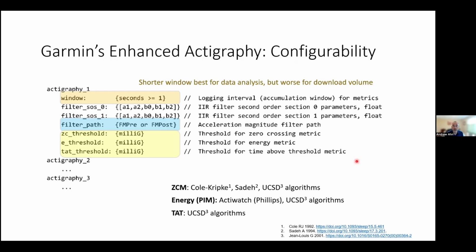However, if you initially record 60-second epochs, there's no way to back that down into more granular 5-second resolution later. So this flexibility in data analysis makes shorter epoch windows a more versatile choice for research, but it has the disadvantage of larger data volume and thus longer data transfer times for the participants. So it would take longer sync time when the person is on our mobile app.